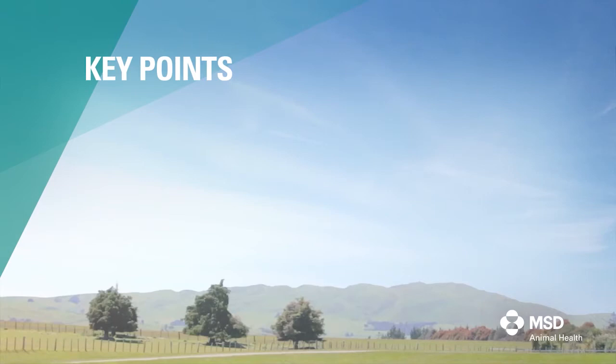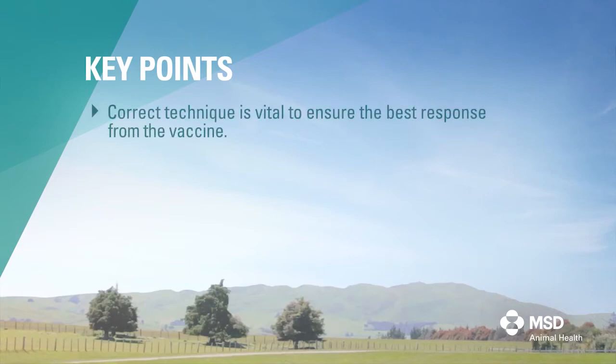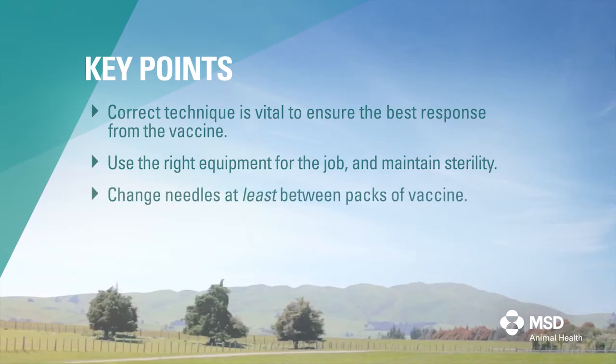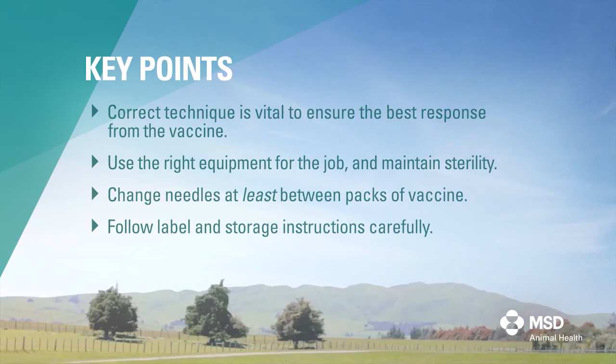The key points to remember are: correct technique is vital to ensure the best response from the vaccine. Use the right equipment for the job and maintain sterility. Change needles at least between packs of vaccine. And follow label and storage instructions carefully.